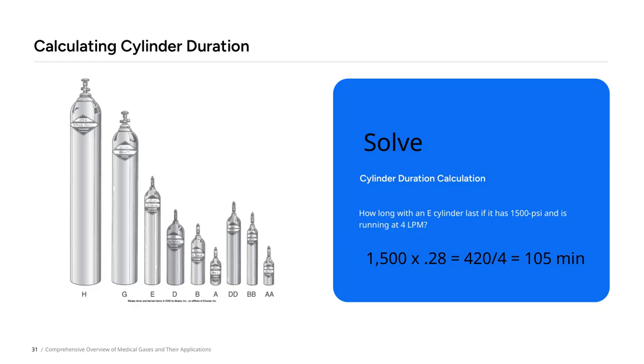This calculation is really useful because it helps us anticipate how long our oxygen supply will last during procedures, ensuring safety and continuous care. It's a simple yet vital part of managing medical gases efficiently.